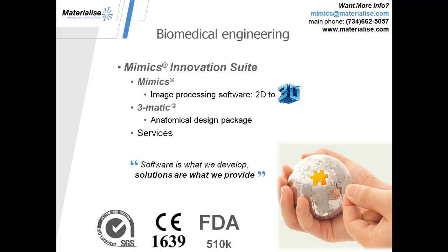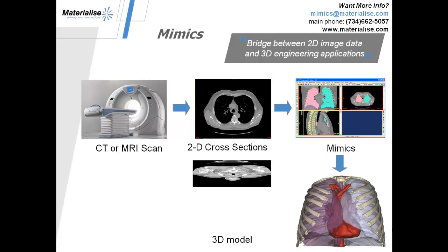And I just wanted to note that our software is ISO certified, has its CE mark, and FDA 510K market clearance, which is also a great thing to note when quality and validation are very important in your process.